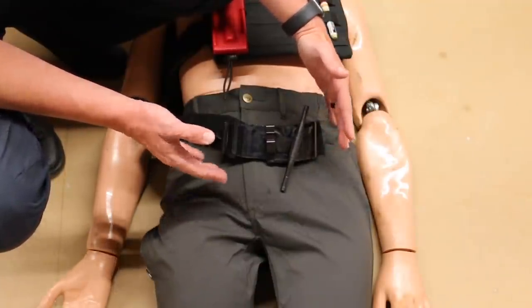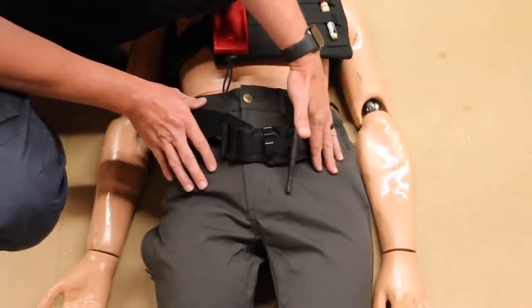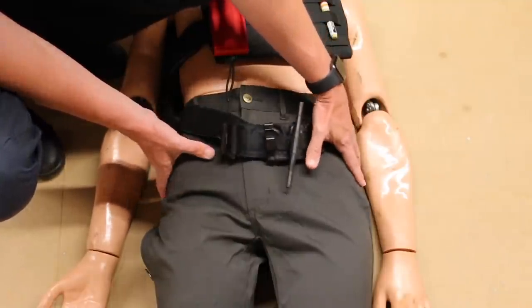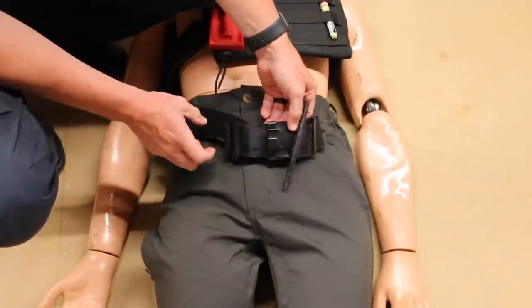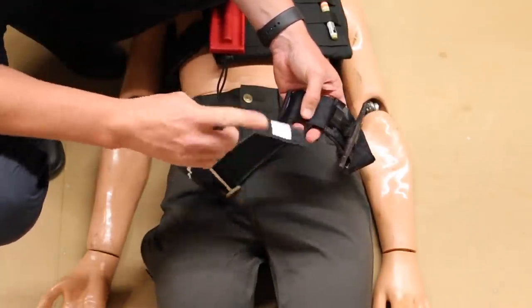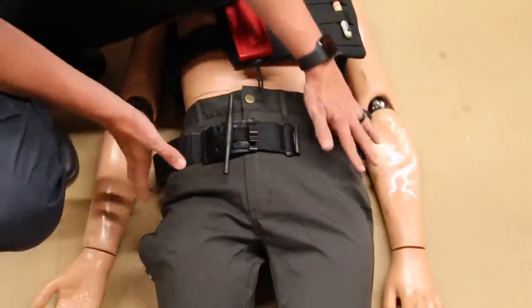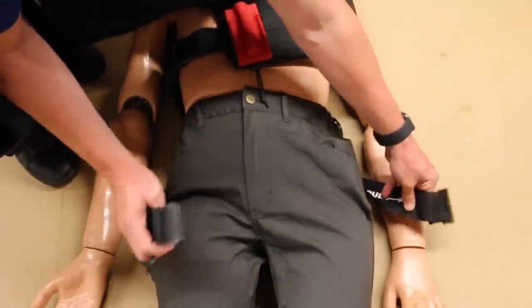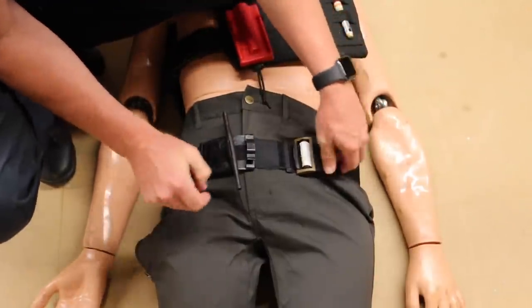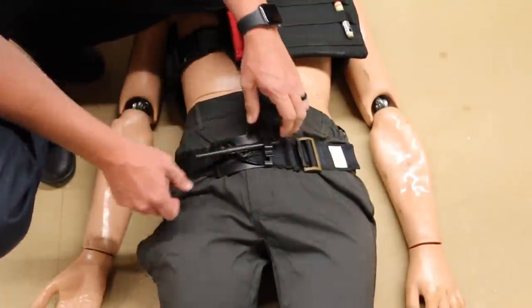Say our patient was hit by a car or fell off a building — we believe he has an unstable pelvis and his heart rate is really high, suggesting he may be bleeding internally in the pelvic area. Because the TMT is two and a half inches wide and 38 inches long, we can use it as a pelvic binder to compress the pelvis down and help control bleeding. I'll slide it up under the small of the back, get it in place, pull it tight, and rotate it just a little to apply pressure onto the pelvis.